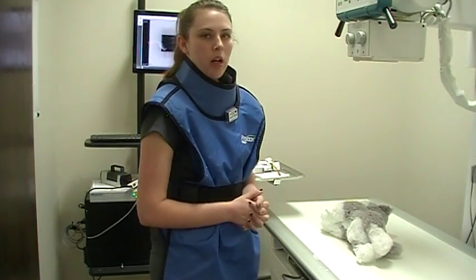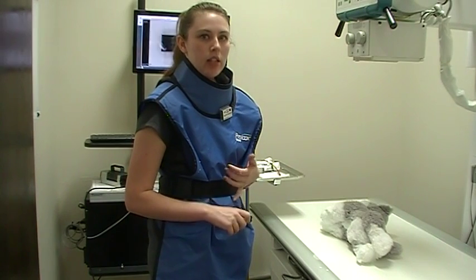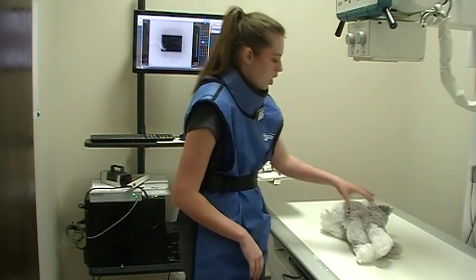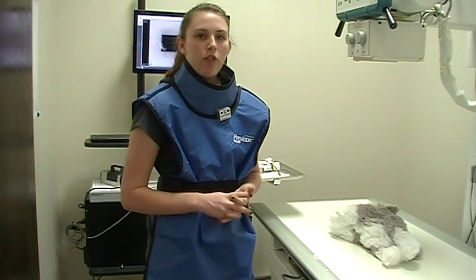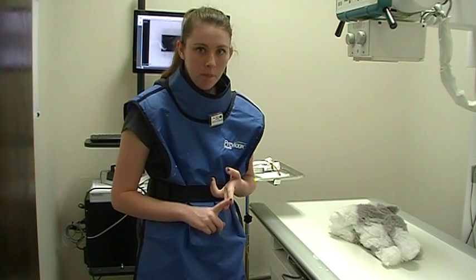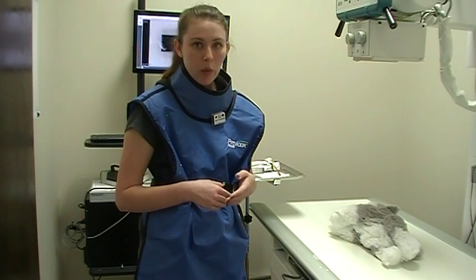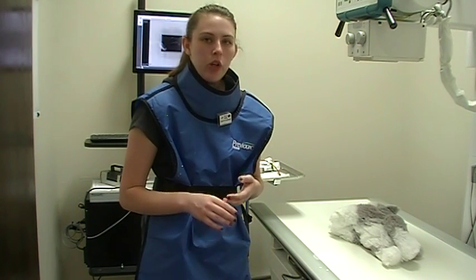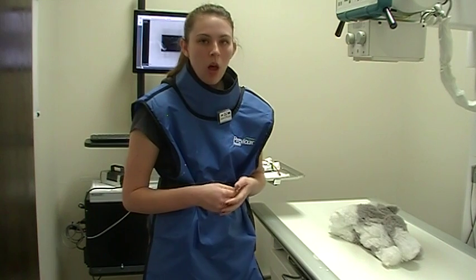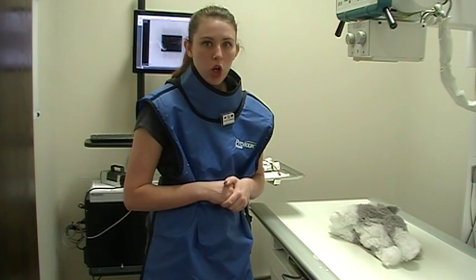We have our two views because one view is not enough on a 3D patient. We can also do a left side down lateral and a DV to get a full look at our patient. After these immediate views, we wait 15 minutes — you can see the stomach making its way into the duodenum. At 30 minutes you can see the stomach, duodenum, and jejunum. At one hour you can still see the stomach, duodenum, and jejunum. At two hours you should be able to see the stomach and complete small intestine entering into the cecum. By about four hours the barium should be completely out of the stomach and you should be able to see the full large and small intestines.